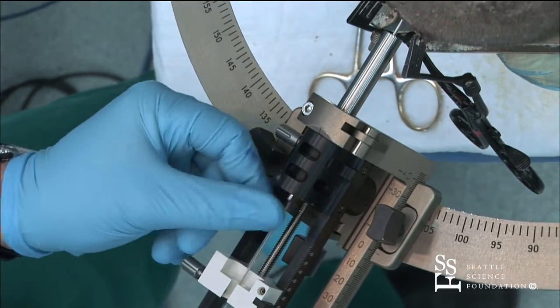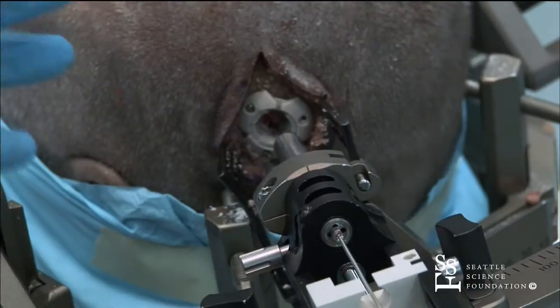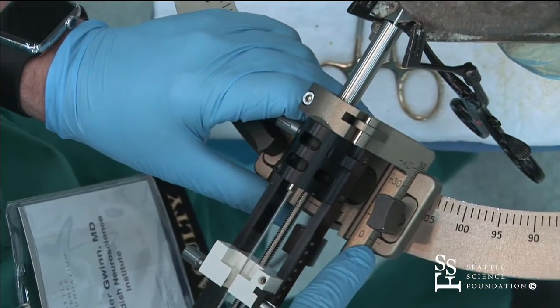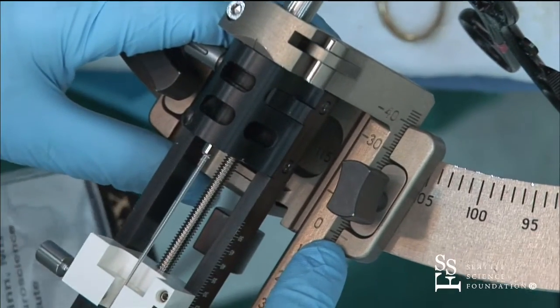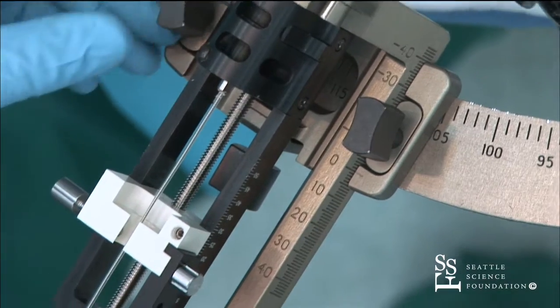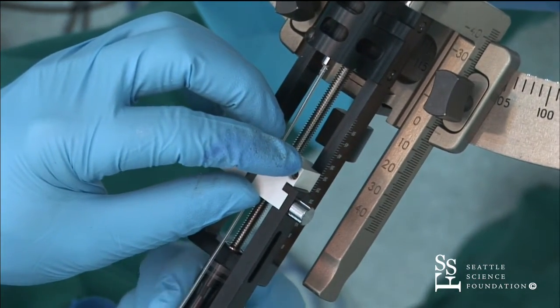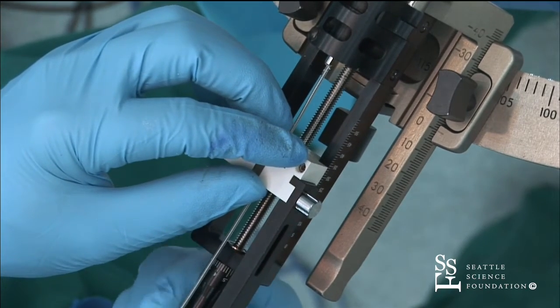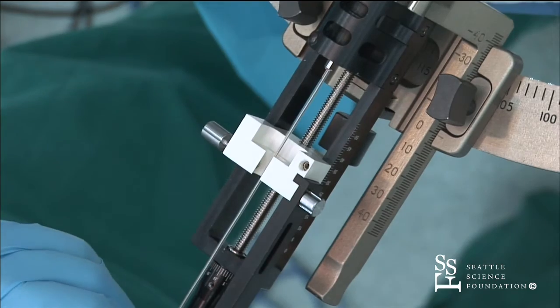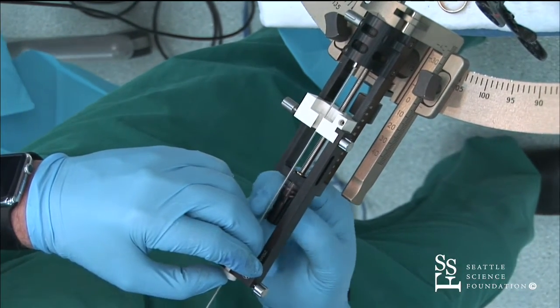So we're going to place that. And when you're using the Lexel frame, it's always important that your zero is zeroed out here at the Lexel frame, as well as that your depth is at 30, because otherwise you will not be at target. So we'll drive this down to 30.